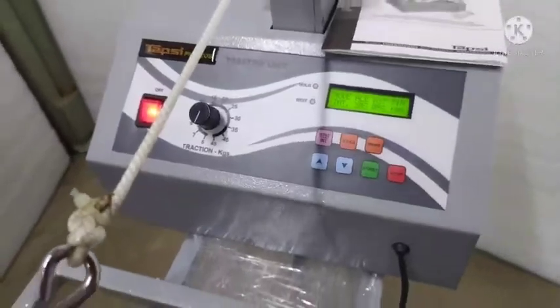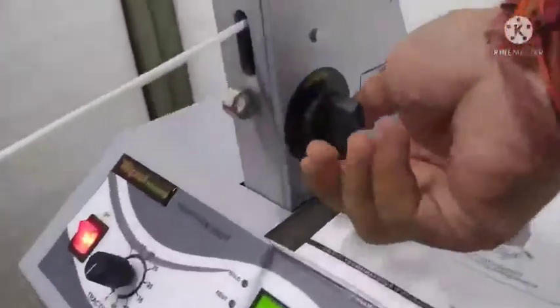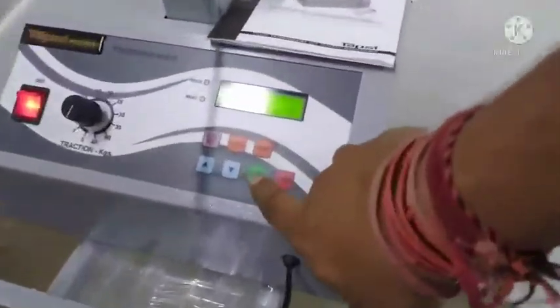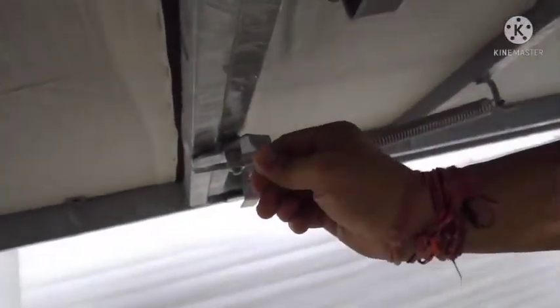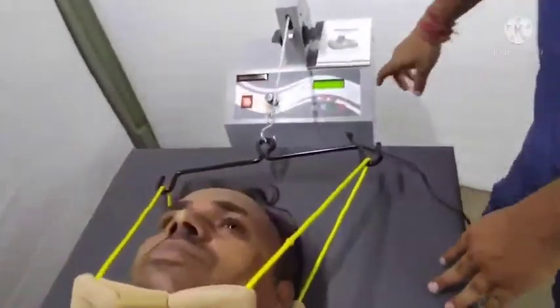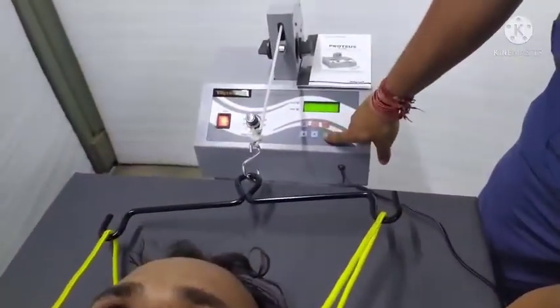and intermittent mode. Okay, now we set the hold and we start the treatment. Before we start treatment, we have to lock the traction table like this, so this traction table can't move. Okay, now we start the treatment.